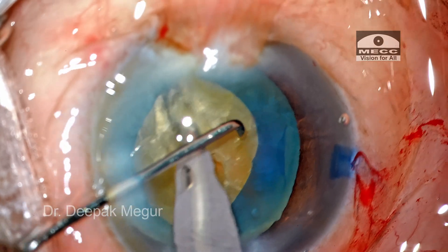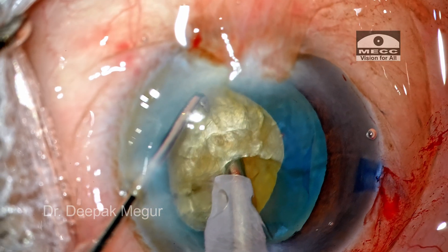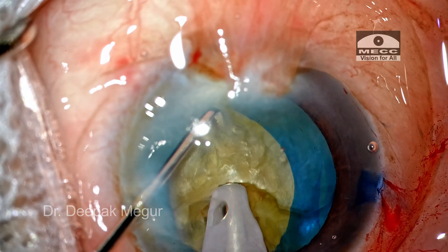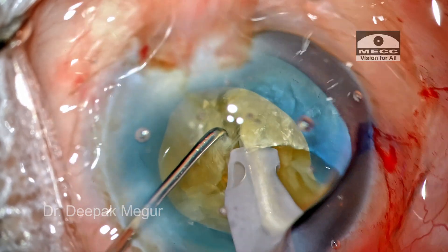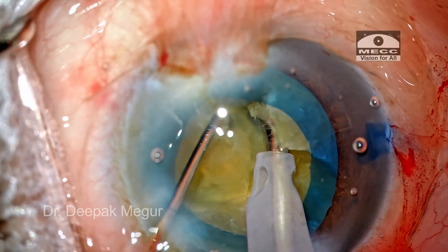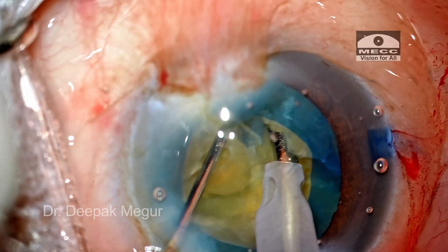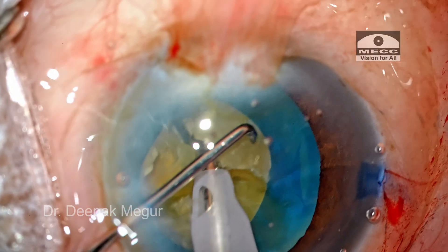The sharp vertical chopper is placed just in front of the tip and then a lateral separation maneuver is performed. I can see a full-thickness crack traversing up to half the length of the nucleus. The nucleus is rotated 90 degrees and the chopping maneuver is continued. As I keep telling, it is not wise to expect the nucleus to crack in the first lateral separation maneuver itself — we need multiple lateral separation maneuvers to ensure that the dense posterior plate gives way.